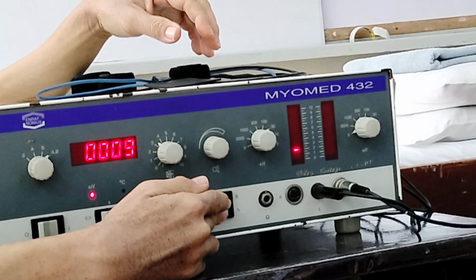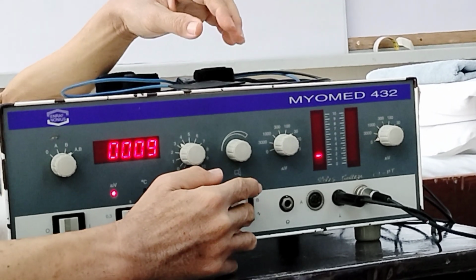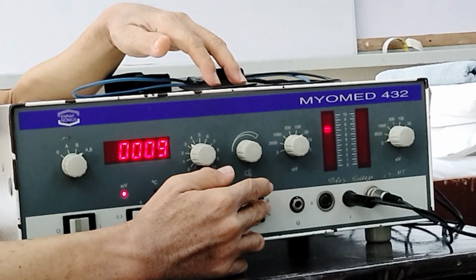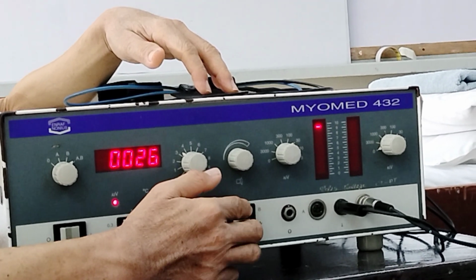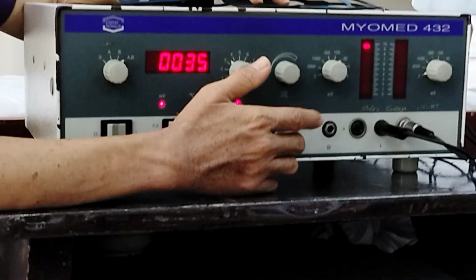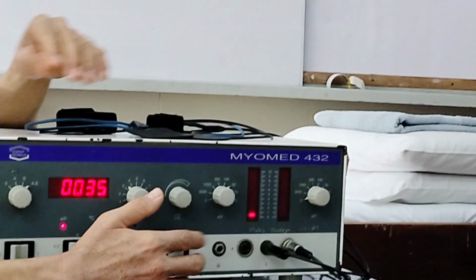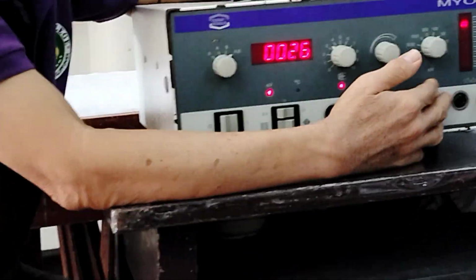Unfortunately, audio is not the only function. It also serves as a signal for control. Although in practice, usually more would want you to use the visual rather than the audio signal. The American instructors want you to do more of the visual.